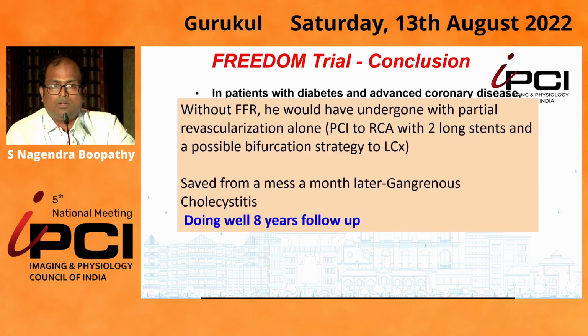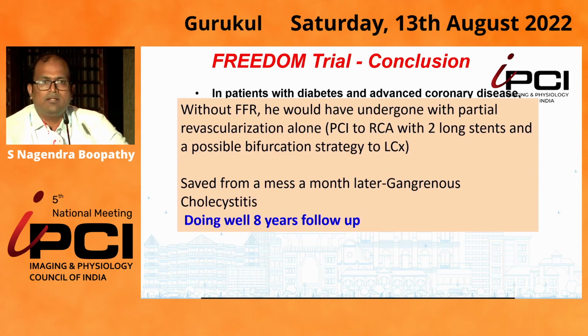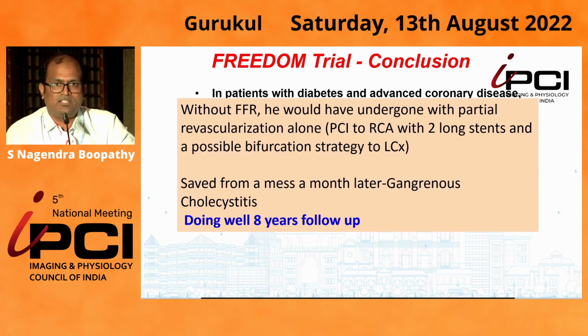Number two, I was thanking myself that I sent the patient for CABG, because a month later he got readmitted with necrotizing gangrenous cholecystitis, for which he had to go for an emergency laparotomy, not laparoscopy, laparotomy and cholecystectomy. If I had intervened with multiple stents in this patient, I would have had to scratch my head, so thanks to FFR.